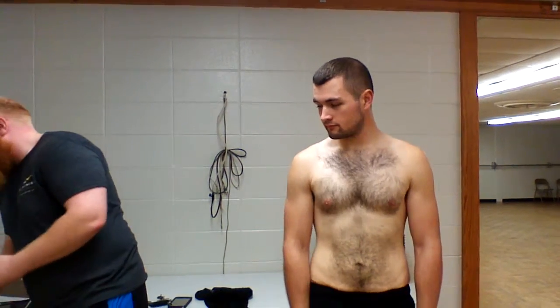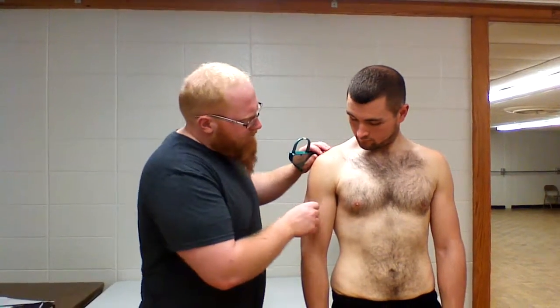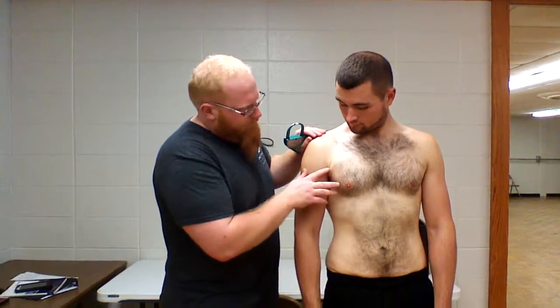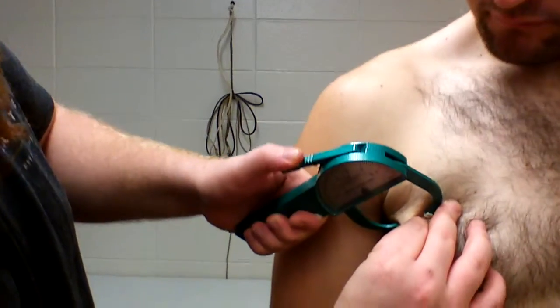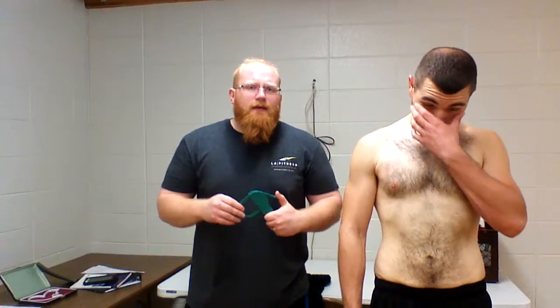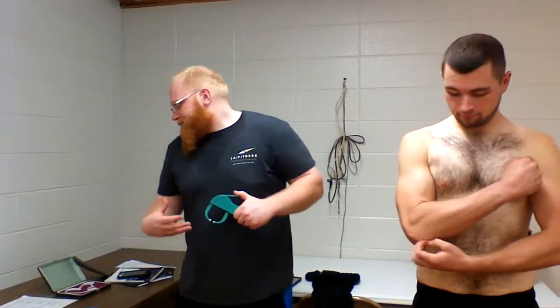Okay. So next we're going to do the chest. For the chest, you want to go right in between the axillary crease right here and the nipple. So right in the middle of the two. We'll get another reading on that one. Usually when you go through this, you want to get at least 2 readings on each one, but cycle through even if you get a bad reading, because you want to let the skin kind of go back to where it was. So we'll redo that one here in a second, and we're going to move on to the mid-axillary.